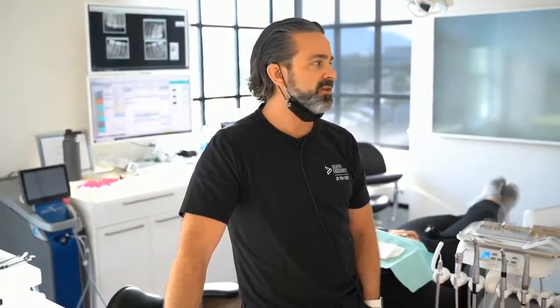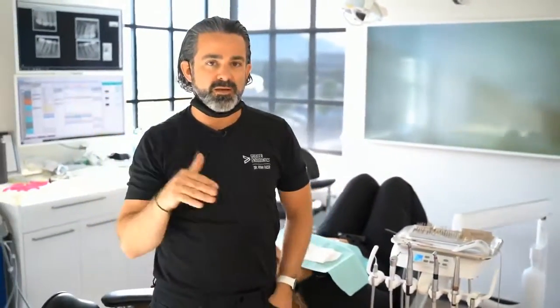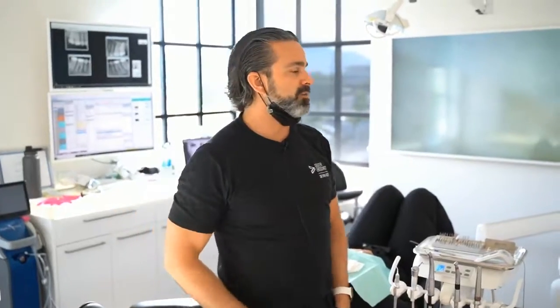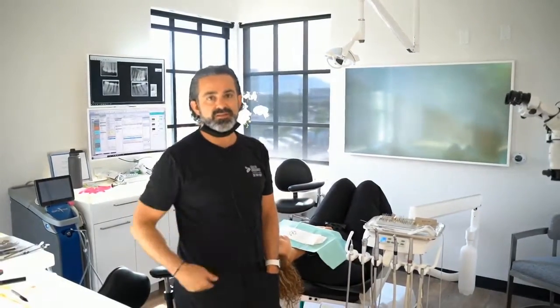I like 12 o'clock. I'm biased because I'm an endodontist, and occlusal surfaces at 12 o'clock are just anywhere in the mouth. For Class 5 dentistry or apical dentistry, these extended arms are important, because that way I can kick my microscope out and come back and look directly, for more of a direct vision on any facial surface, like I said, during Class 5s or interproximal Class 2s.